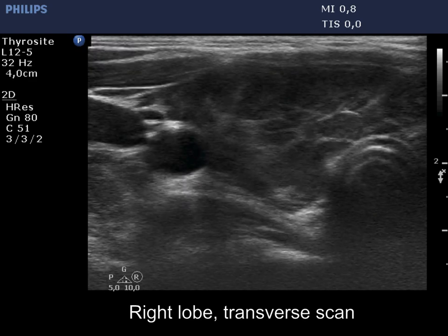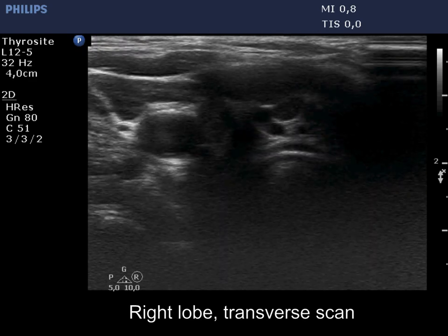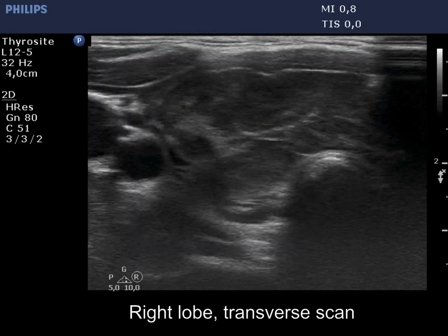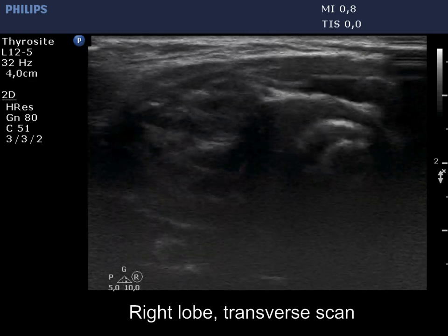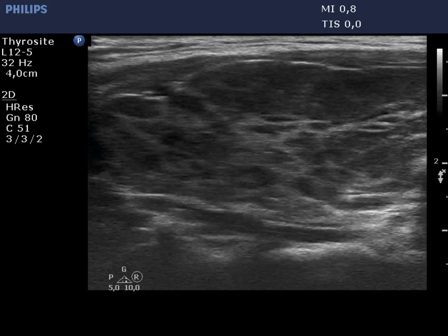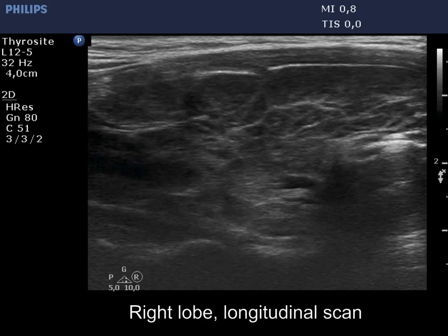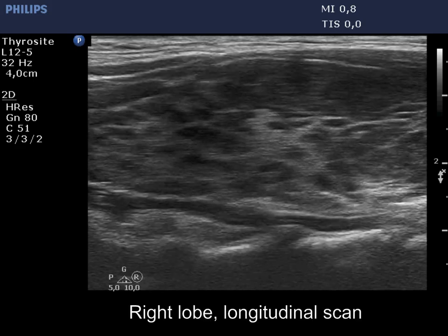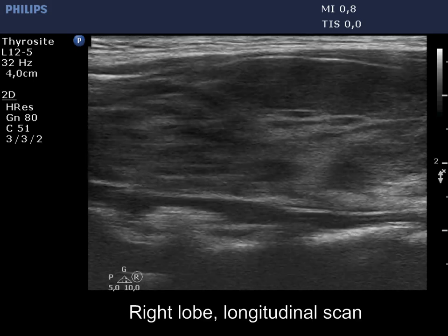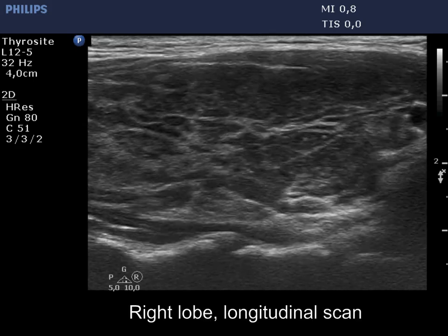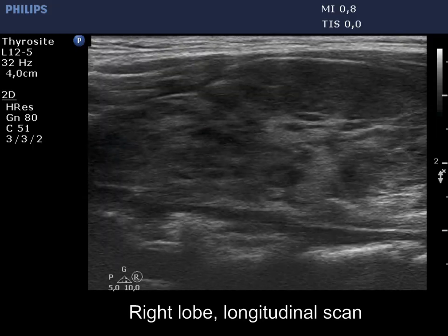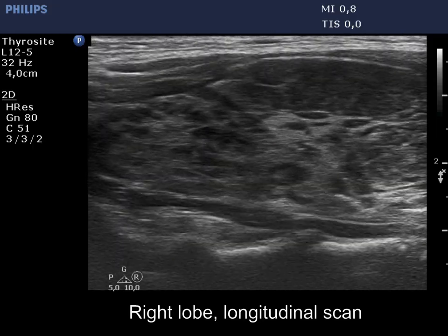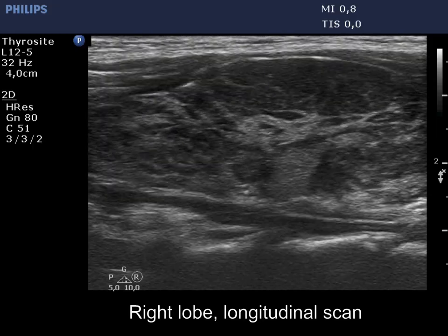The thyroid is composed of echonormal and hypoechoic areas. The former corresponds to those parts of the lobe which are not affected by the thyroiditis. The pattern is close to the honeycombing subtype of lymphocytic thyroiditis.